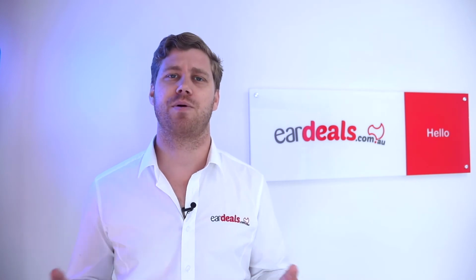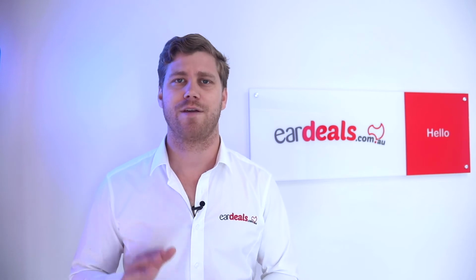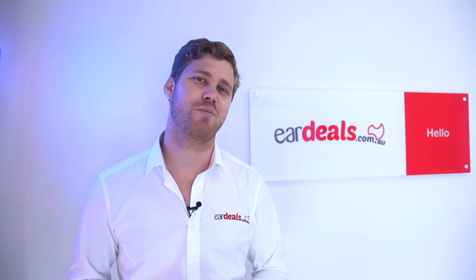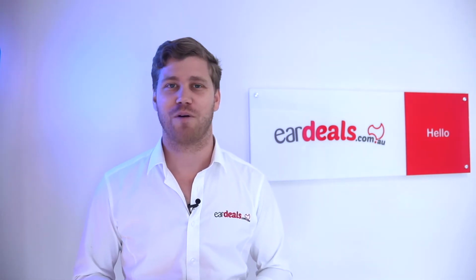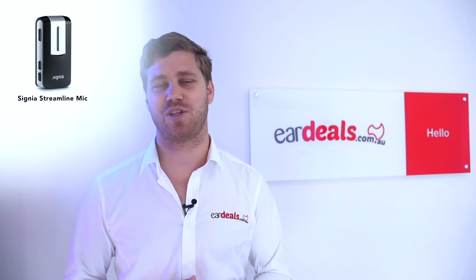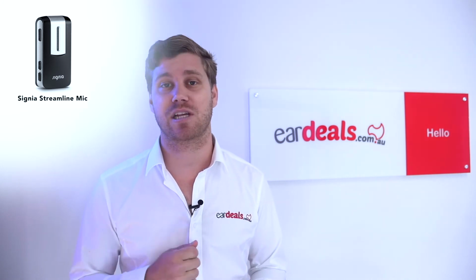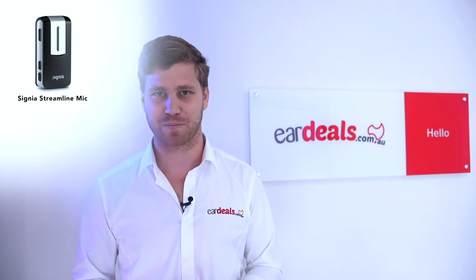So if you are someone with an Android device, it may not be the option for you if you're not willing to purchase an additional accessory. It is also important to note here that that additional accessory also gives you the capability of distinguishing sound in noisy environments, because it's actually called the Streamline mic, and the Streamline mic gives you the capability of being able to distinguish noise easier if it's clipped on a lapel of, say, a friend across the table at a cafe.